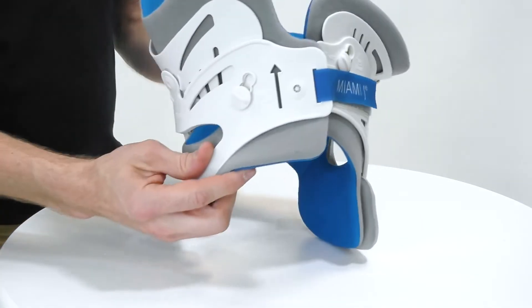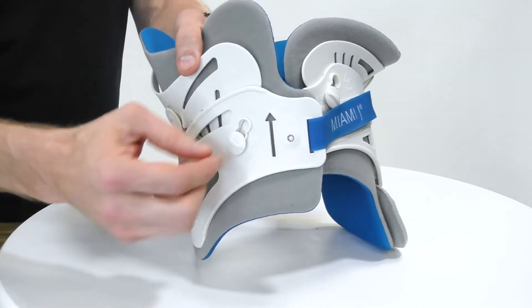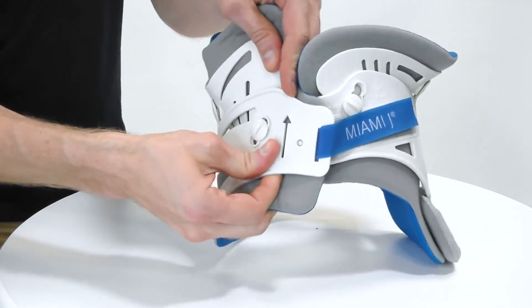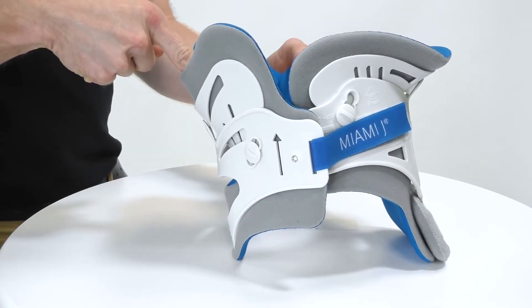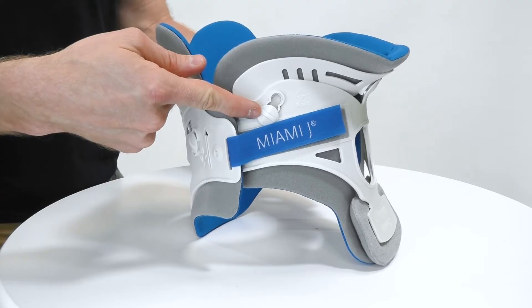We can also make adjustments to the shaping of the collar using these angulation buttons, which can be quickly unlocked, adjusted and then re-locked in order to change the occipital angle posteriorly and the mandibular angle using the anterior angulation button.